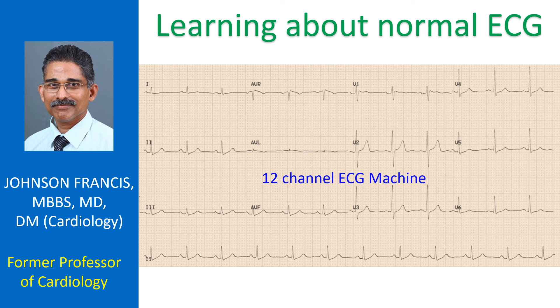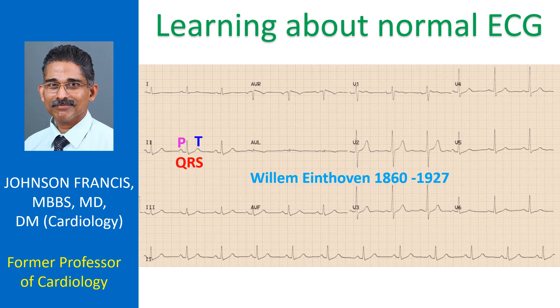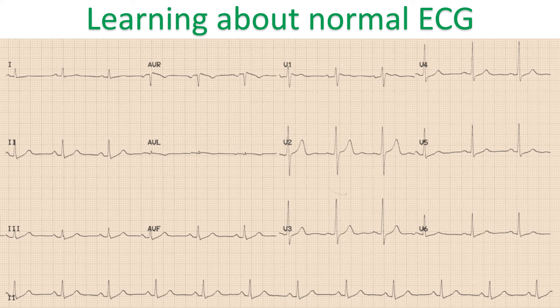This particular tracing was recorded using a 12-channel ECG machine. In a normal ECG, P wave, QRS complex, and T wave are usually all positive in leads 1, 2, and 3, as Einthoven designed the lead system so that all standard leads would record positive waves in a normal individual. Though QRS is positive normally in these leads, P wave and T wave polarity can show some variation in normal individuals as well.